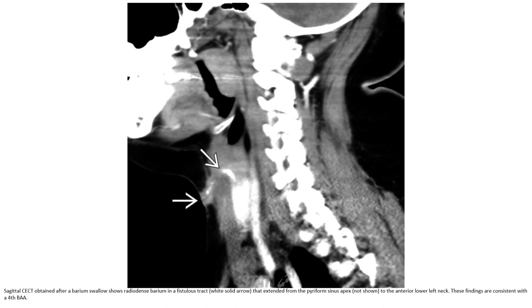Sagittal contrast-enhanced CT obtained after a barium swallow shows barium in a fistula tract extending from the piriform sinus apex to the anterior lower neck. These findings are consistent with a fourth BAC.